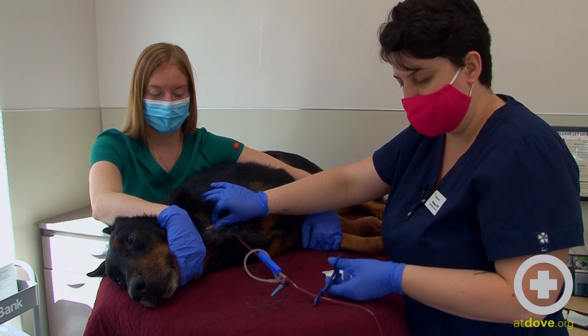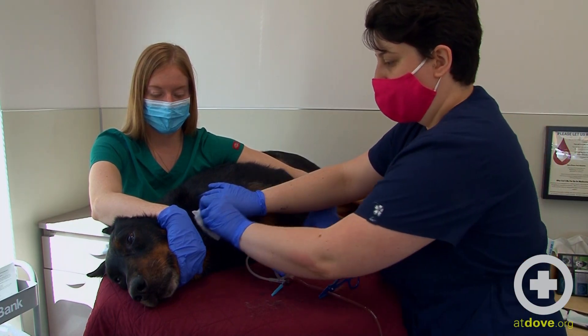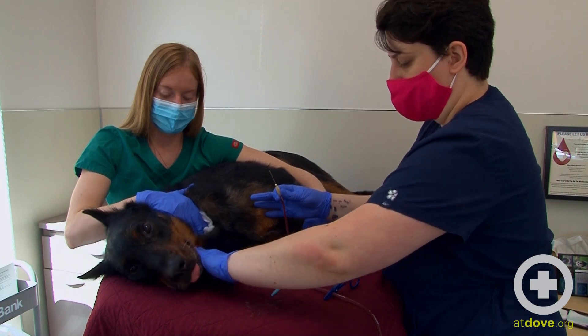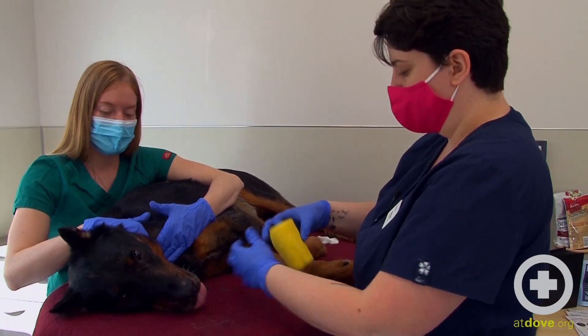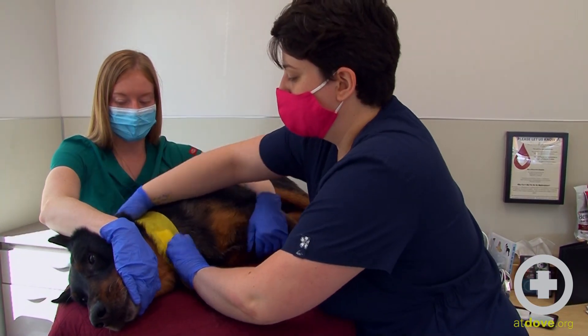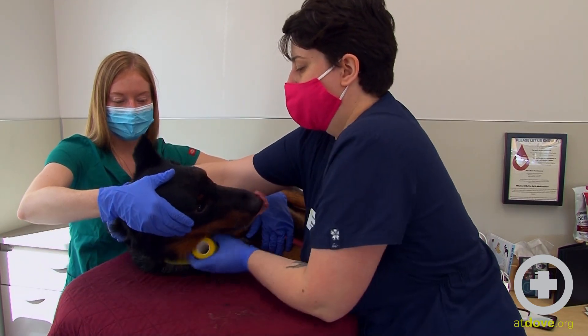When you're done with the donation, before you pull your needle out, you want to clamp the line again to keep it a closed system. Apply some clean gauze before you pull out and have your assistant hold off there. Once we are done, we are just going to apply a light pressure wrap to this area, keeping the gauze in place.